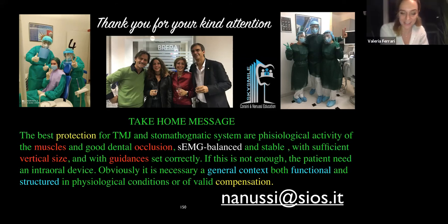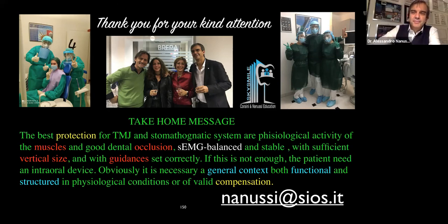Thank you so much, Dr. Nanussi. Your presentation is always amazing, so thank you so much. And I have a couple of questions. There's a lot of people that are writing that everything was really well explained, and they thank you. But I just want to focus a little bit on a question that I think is so interesting also for you. They want to know how to train the muscle when patients have a bad calibration. So you do a training in that sense.